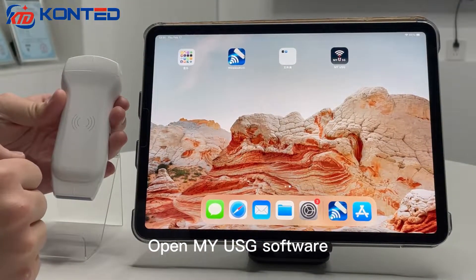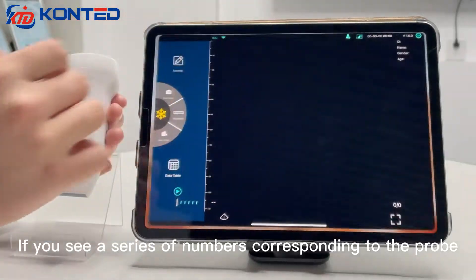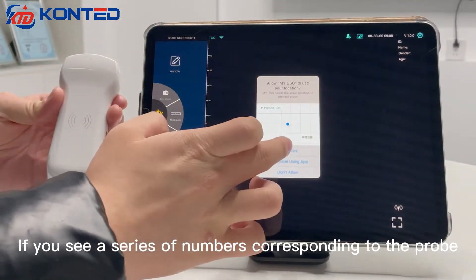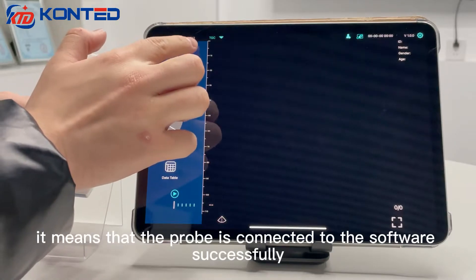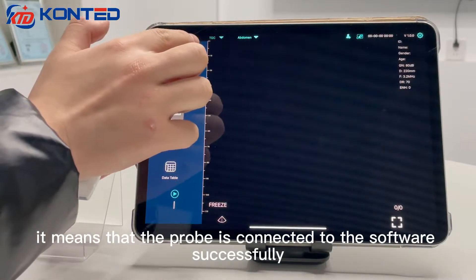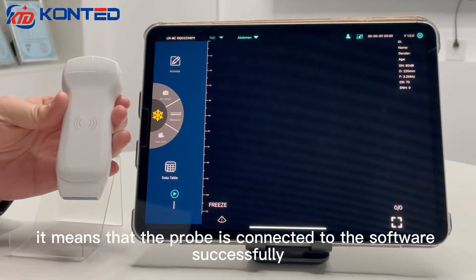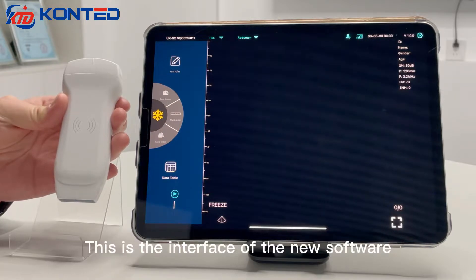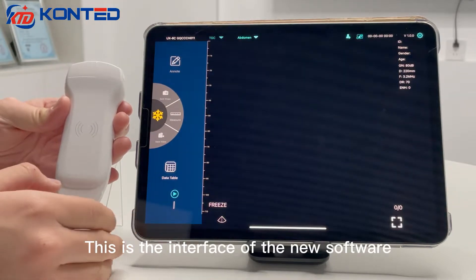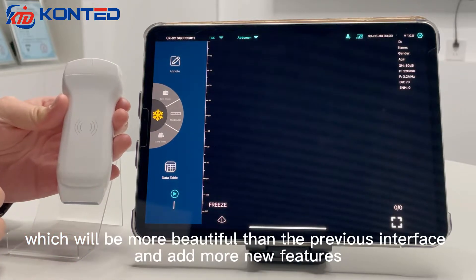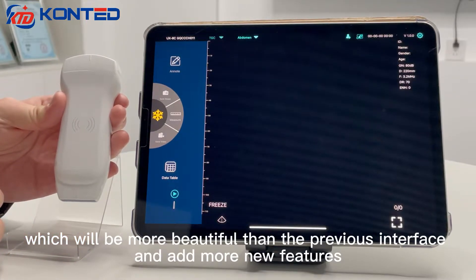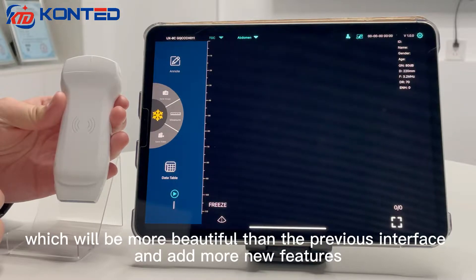Open the MY USG software. If you see a serial number corresponding to the probe, it means the probe is connected to the software. This is the interface of the new software, which is more beautiful than the previous interface and adds more new features.